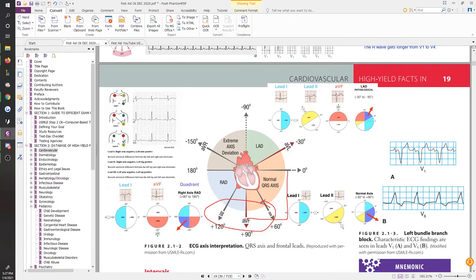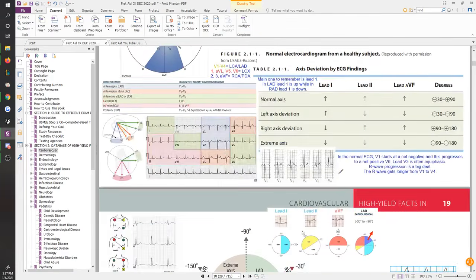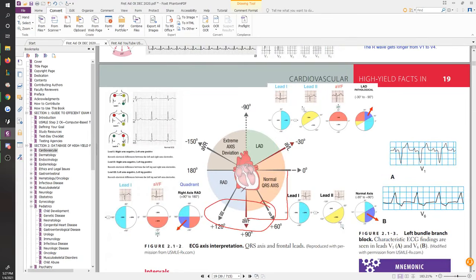As you already know from what we just talked about for this blue area and what we're talking about evaluating ECG. So if someone has an inferior MI, that would mess up this area, and more power would essentially be shifted towards the left, making this normal axis from here to here actually shift in this direction, so that the normal axis would become something like that.